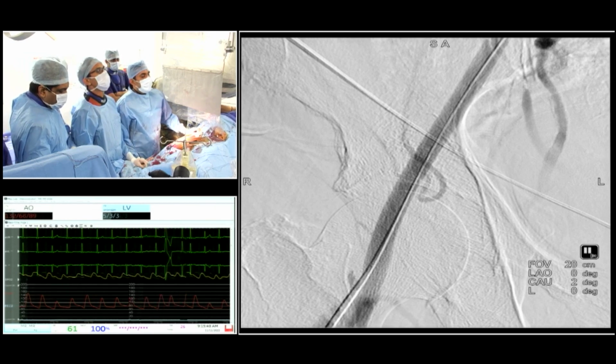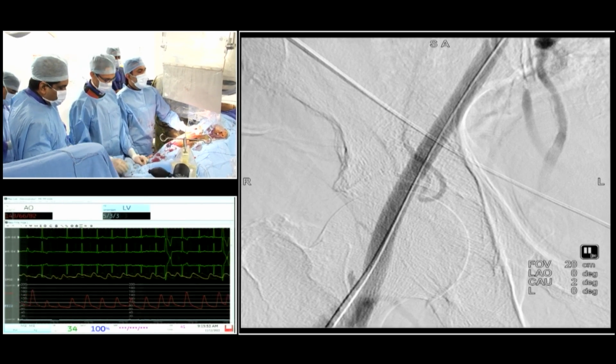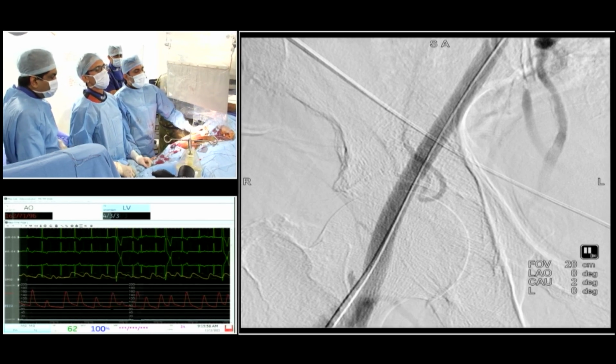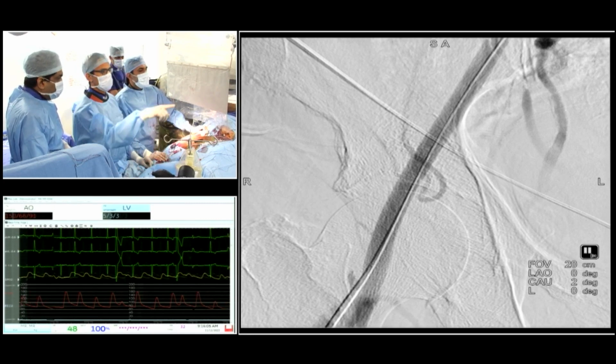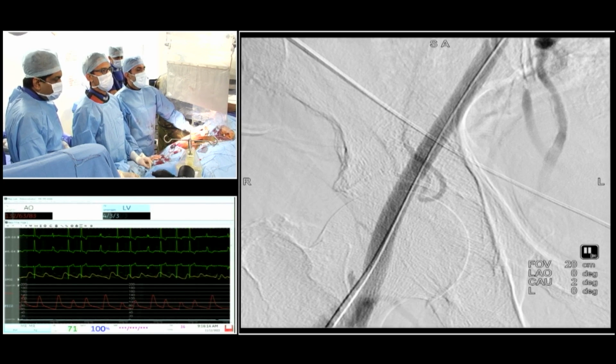When we started the vascular closure device, we were all using 2 ProGlides because the system was 18 French, or maybe the OD was 20 French. Now we have come down to 14 French. So what has been accepted in London Valve is you do 1 ProGlide, and the second closure device is an ad hoc device. It could be an Angio-Seal or a ProGlide or Perclose. It's all the same. How we choose: if there's a pulsatile flow, use a vascular closure device, which is a ProGlide. But if there's no pulsatile flow and it's just some oozing, then we would go ahead and do an Angio-Seal.